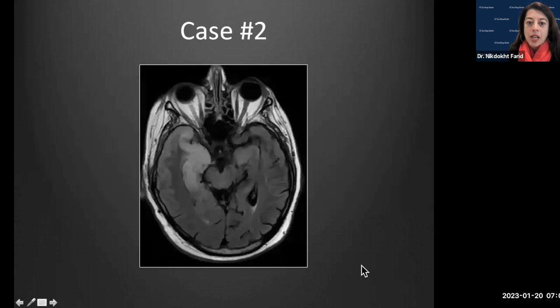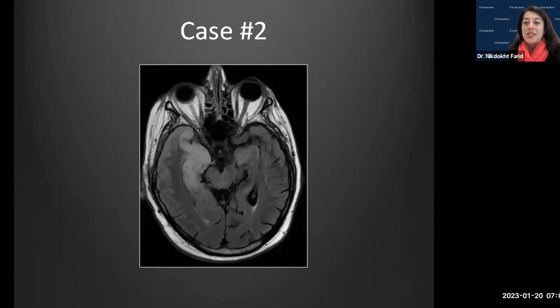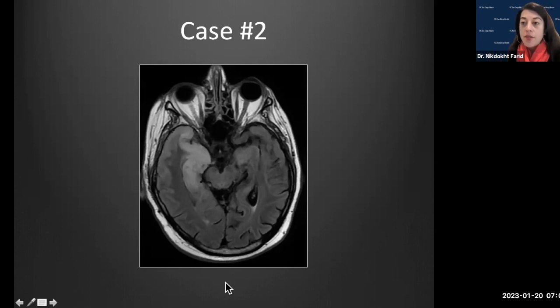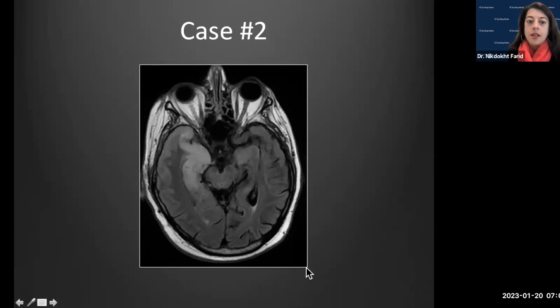Case one shows an axial T2, an axial T1 post-contrast, and a representative image from MR spectroscopy. Case two is a single axial FLAIR image. All five cases are going to be intracranial infections, which should help narrow the diagnosis.